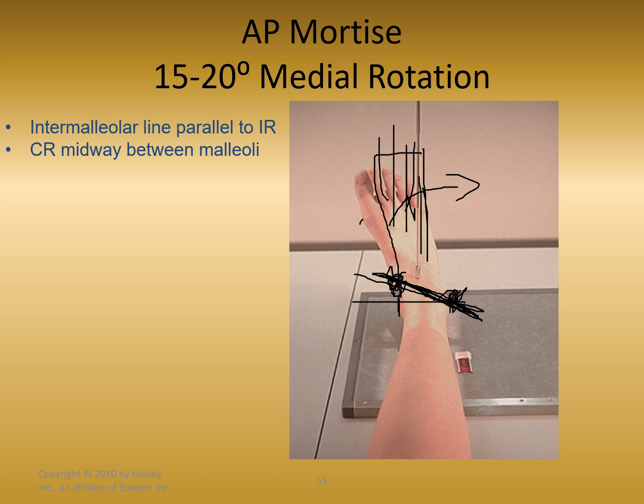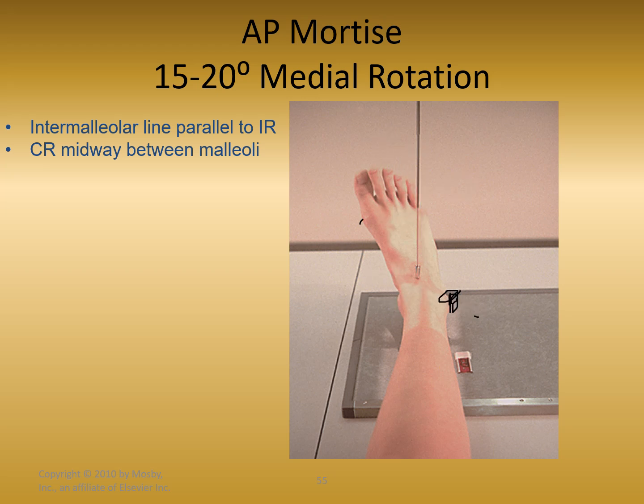That's that 15-degree angle that would be made with the IR. In this case, nope, we're looking at a rotated foot. In this picture, we're actually looking at a foot that's been rotated to place that intermalleolar line parallel. We can see the lateral malleolus. We can see the medial malleolus. We can draw a line straight across them and see how parallel that is with the IR because they rotated the foot that 15 to 20 degrees. So important to understand this positioning.